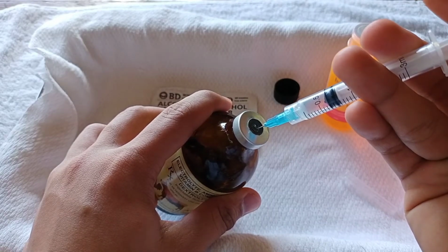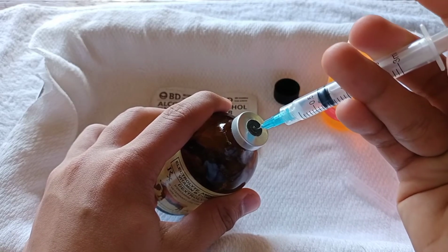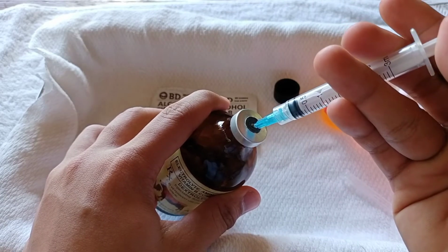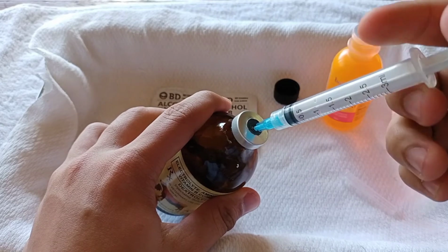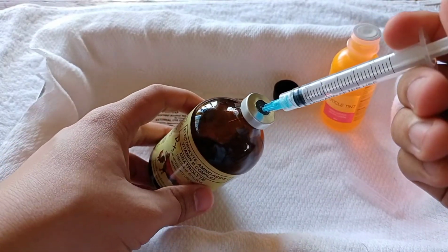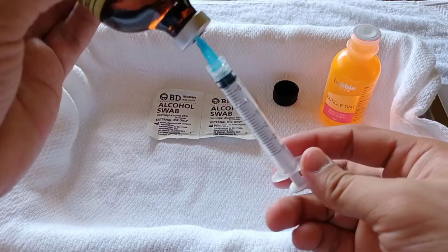Continue insertion until the needle is secured in the vial yet above the level of the fluid. Press the end of the plunger down to instill air into the vial. Hold the vial with the non-dominant hand and turn it upside down.